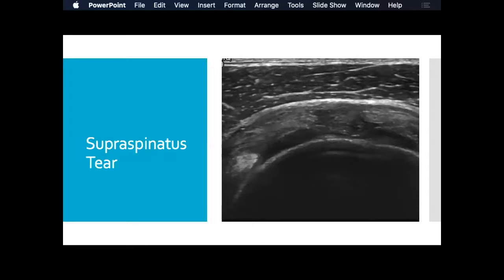You see this really ratty appearance. This is a full thickness tear. With tears, you have basically the 3 degrees, a little bit more, and then completely. This is the complete tear that's all the way through. Like I said, ratty appearance, the dark fluid in between the crisper images, and the tendon is a little bit ratty looking. It doesn't have that nice linear appearance because it's bunching up. So that is a complete tear.